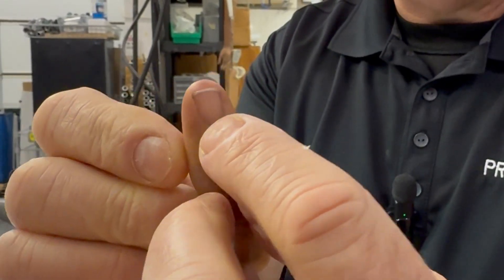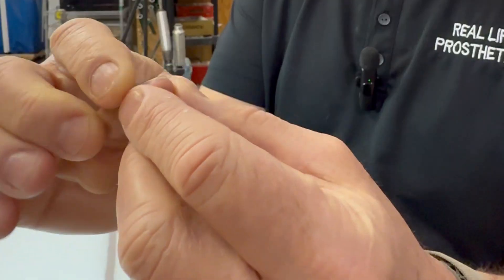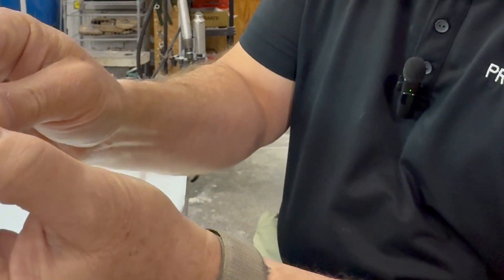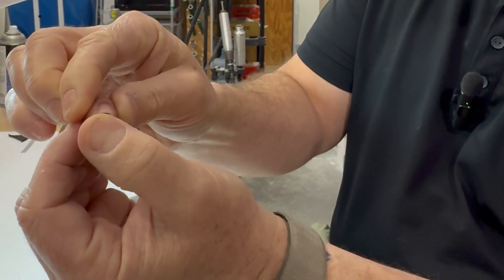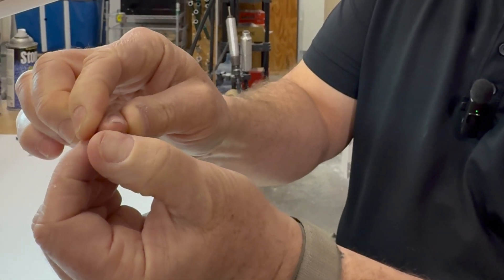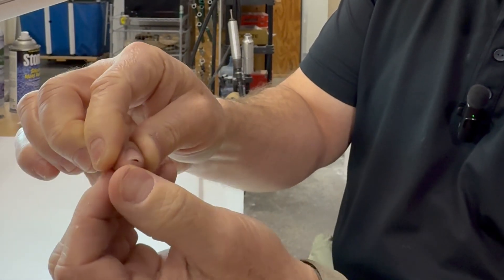I take a look around the nail, making sure that the cuticle area is intact. I take a look at the nail bed, and I can see that he is getting some separation. I'm going to have to re-bond the underside of the nail bed to the finger to make sure the nail doesn't start to pull out more around the edges.